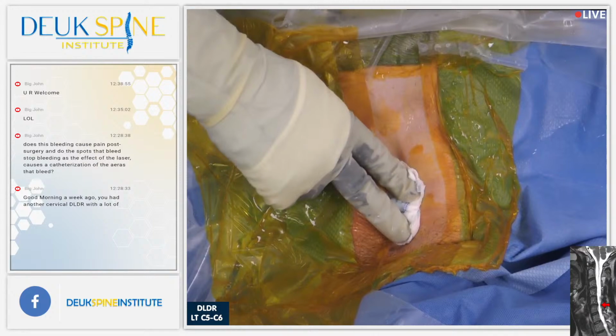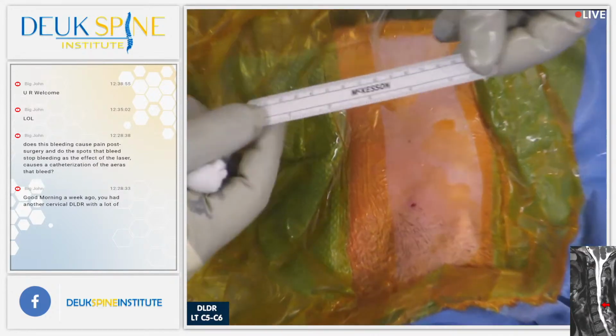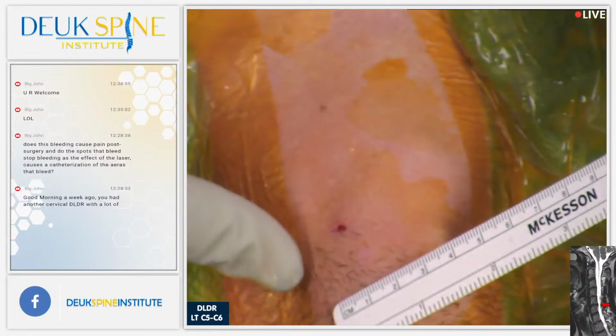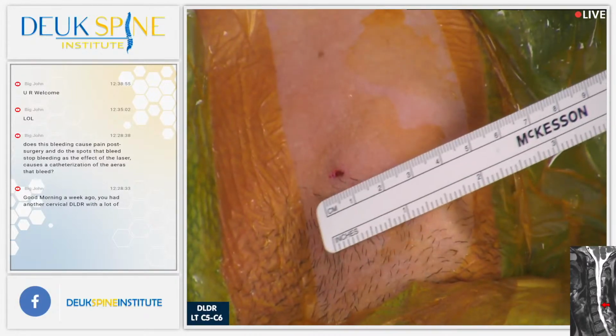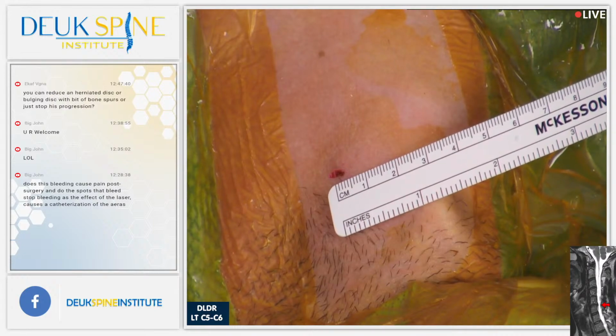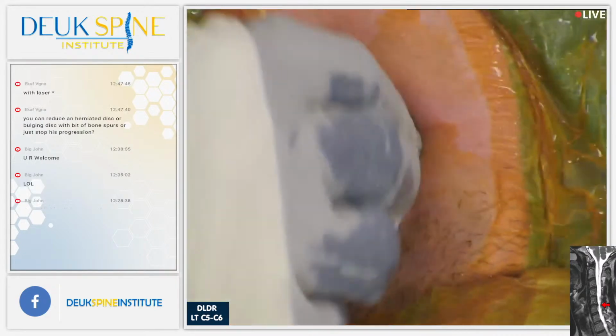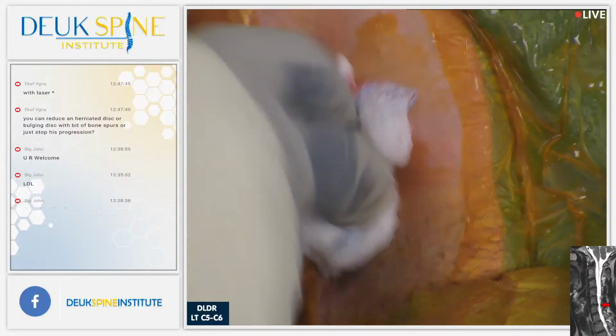Whenever you're ready, Luis. Oh, by the way, take a look at the incision. Look at that. That's the hair of his beard right there. You see the hairs of his beard, the Adam's apple? That's how small the incision is. 4 millimeters. Good picture there, Henry? Yes, perfect. Send me that one too. Copy that. No bleeding. We had 1 drop of blood, folks.